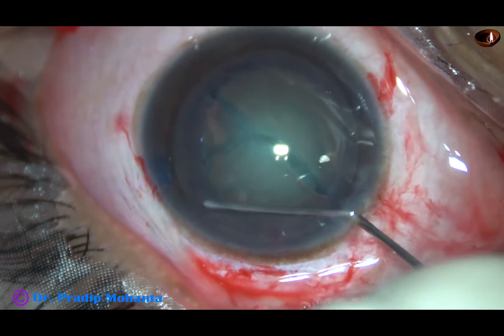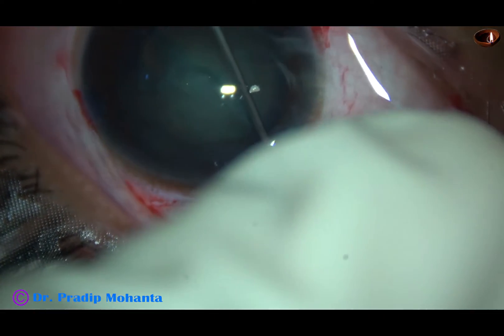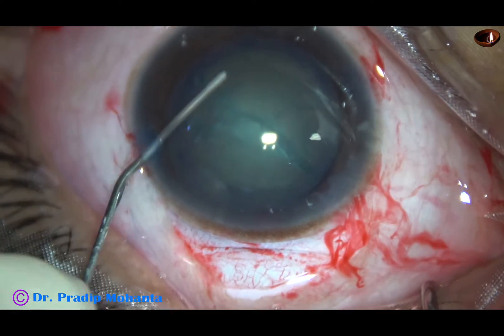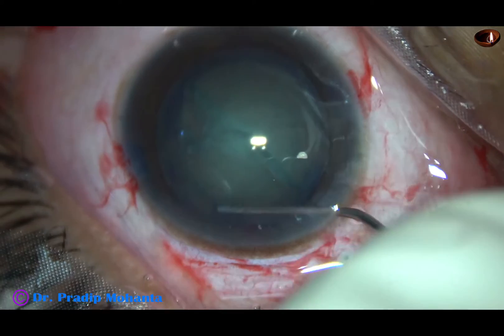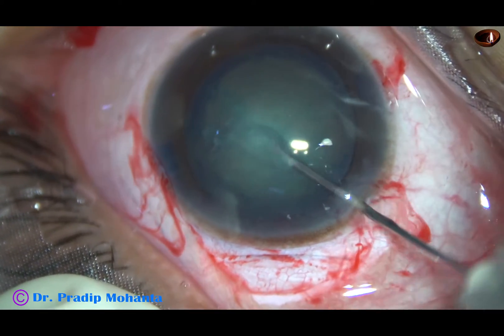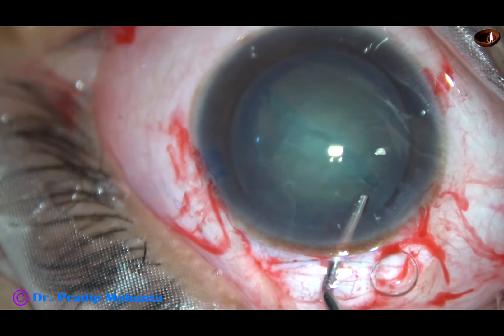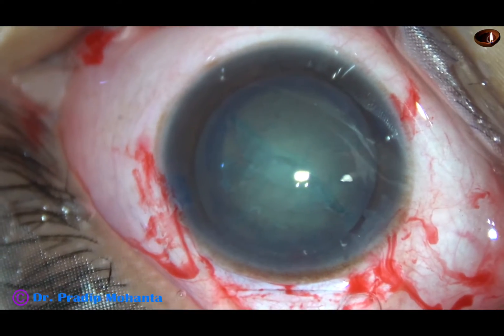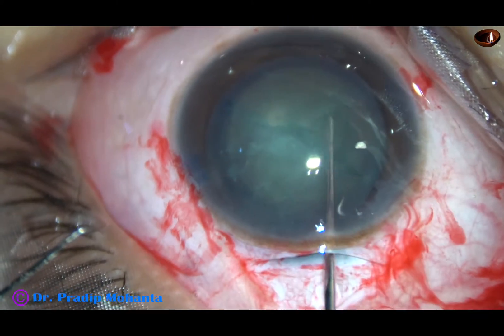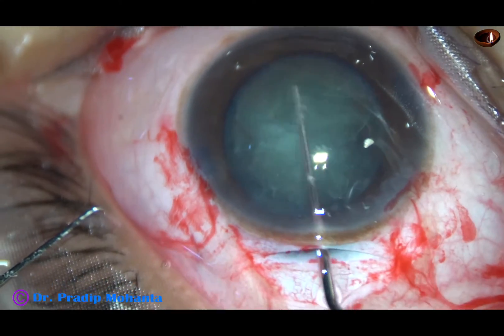Now hydrodissection is being done very gently. Only a small amount of fluid is being injected, and very gently I am trying to mobilize the nucleus. But the hydrodissection is not good — the nucleus has not got separated from its capsule yet. I am going to try to prolapse this nucleus out of the capsular bag, but I find that the nucleus is not rotating and I cannot mobilize it.